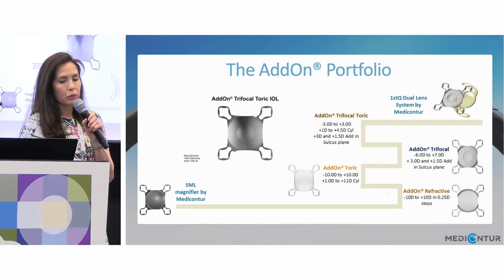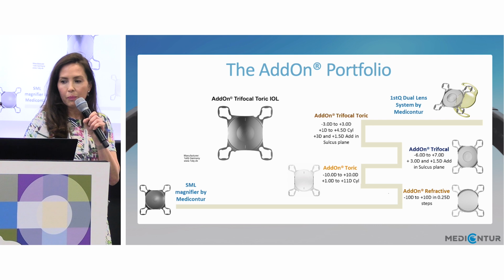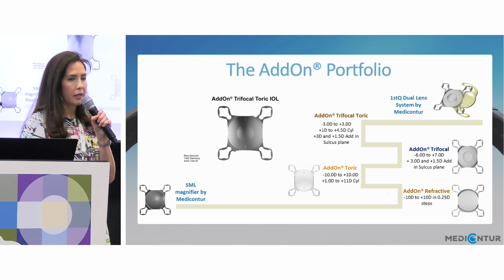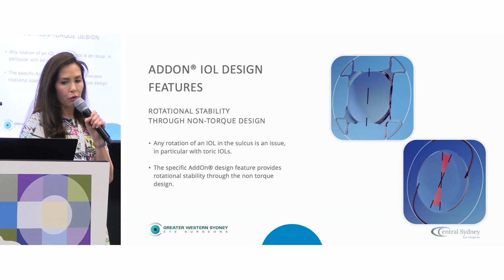The portfolio includes monofocal, toric, multifocal toric, plus a lens with a high near add for your dry, stable AMD patients, and that's a very discrete section of patients, but that's the Charioth macular lens. It can also be used at the time of surgery, where you may decide to put two lenses in at the time rather than sometime down the track of the original cataract surgery where the patient is pseudophakic.